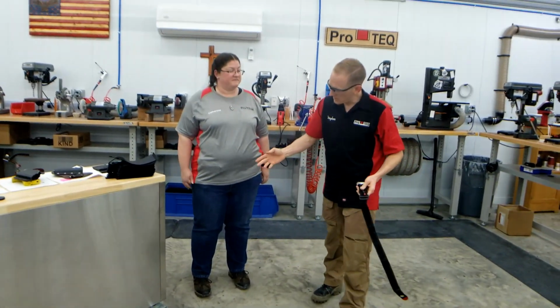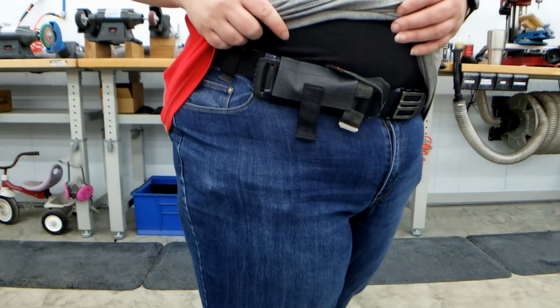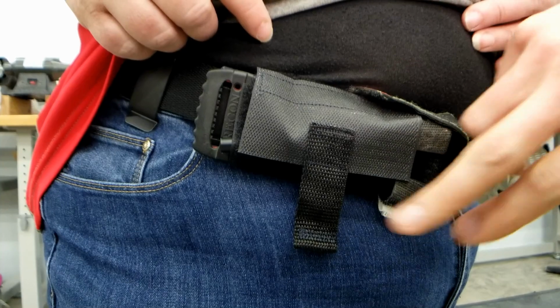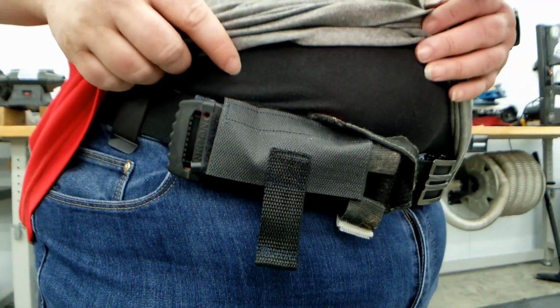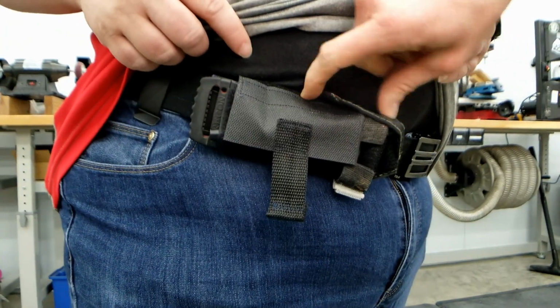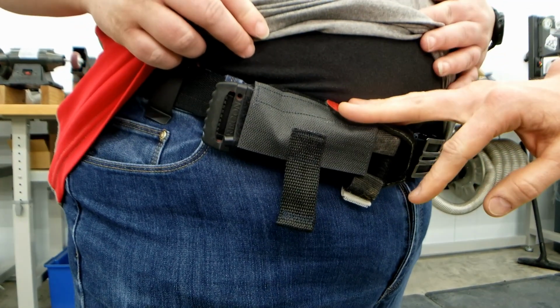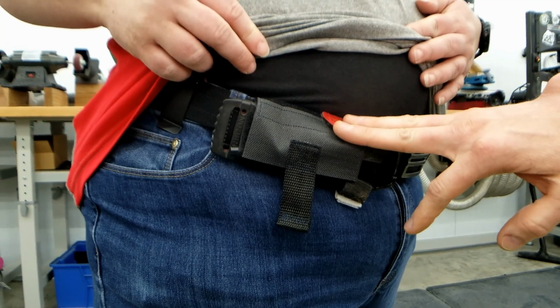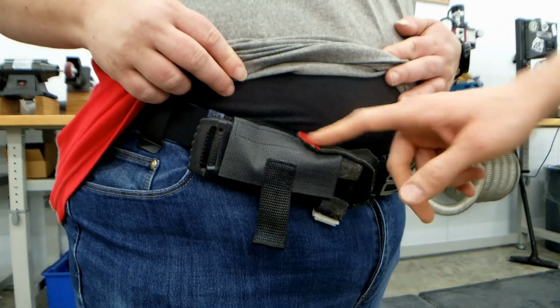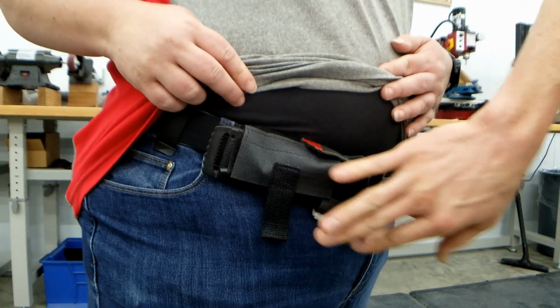But anyways, the tourniquet holder is right here. Catherine's got her own on. Come on in, let's get a close-up. This is what it is. It's a simple nylon Velcro combination. You've got a little pull tab here that you can pull up on to release it. Or you can do like I did. I just grabbed this, held it in place, grabbed my red tab on the tourniquet. Also, we like to leave these out and exposed so that if she's down with a gunshot wound and unconscious or whatever, somebody who knows what they're doing can say, hey, that's a tourniquet right there, I can use that, and they can grab it and go. But that's kind of how we stow them on the belt.